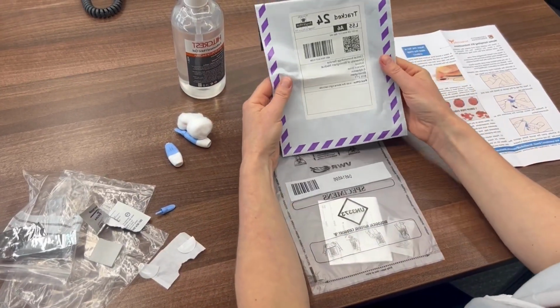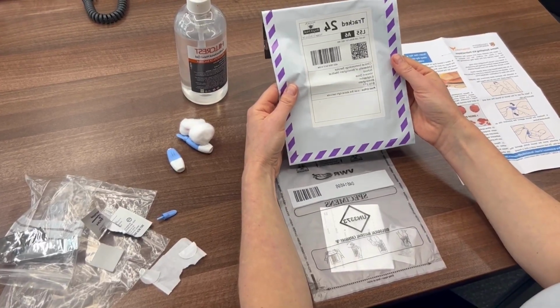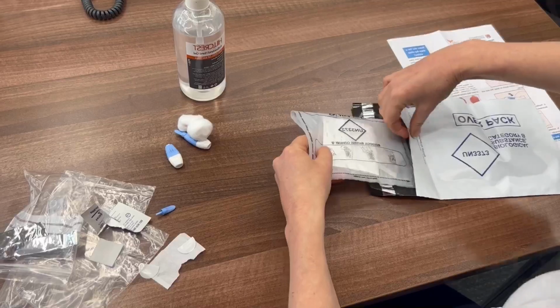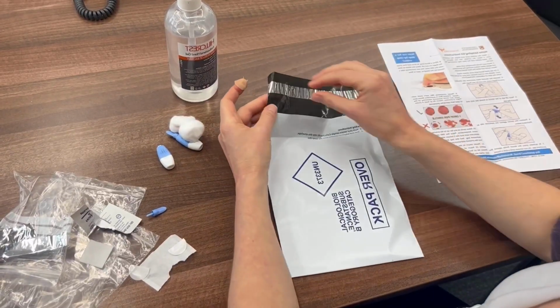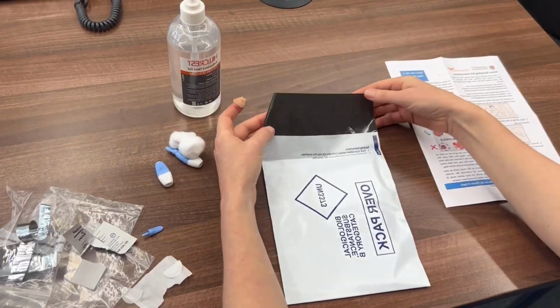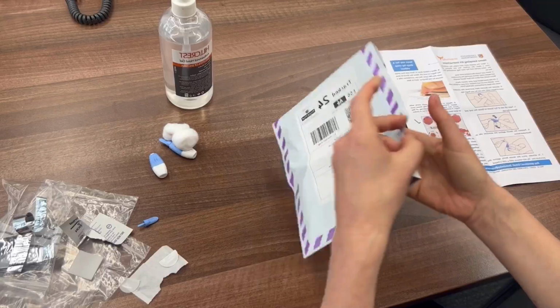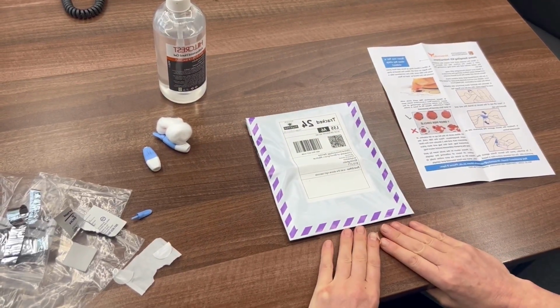We then have a labelled and prepaid for envelope. So you then put your specimen bag into the return envelope, and again remove the seal cover and then pop that down. Now your sample is then safe to put into the post.